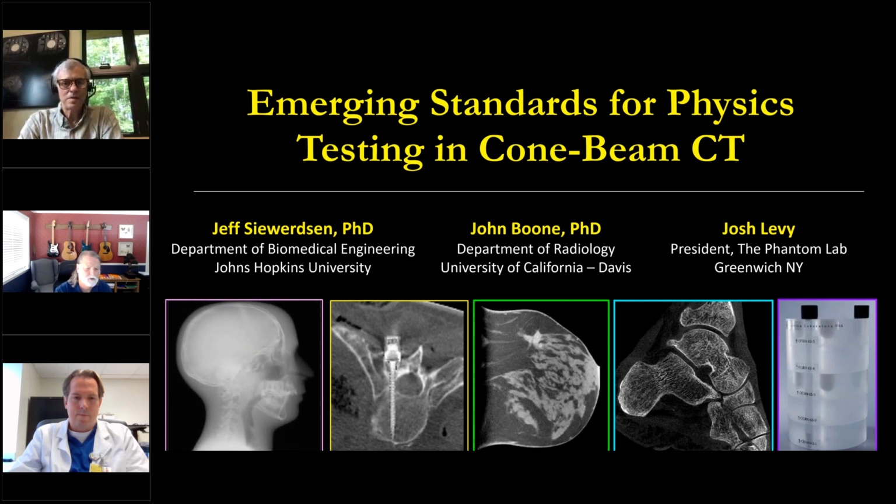I'll draw your attention to the ankle picture over to the right. Jeff has also been involved with a commercial company to develop what is now available commercially, an MSK bone imaging system for extremities, and you can see the detail visible there.